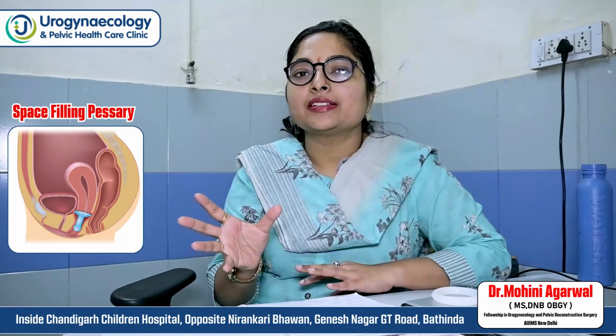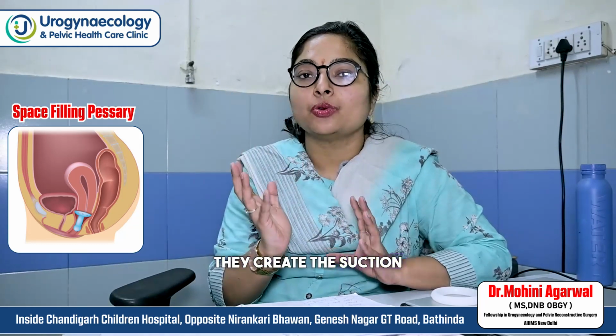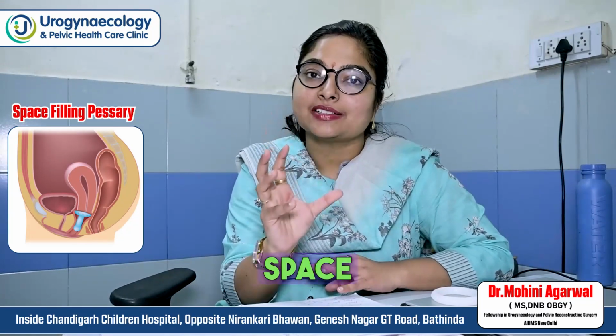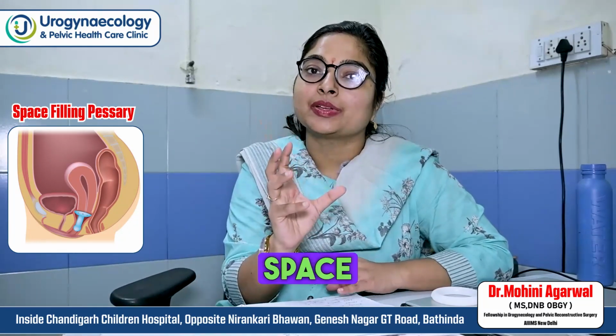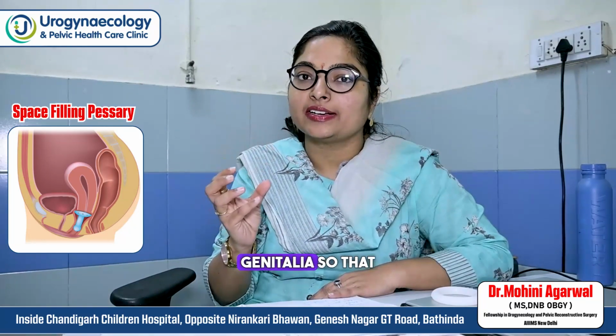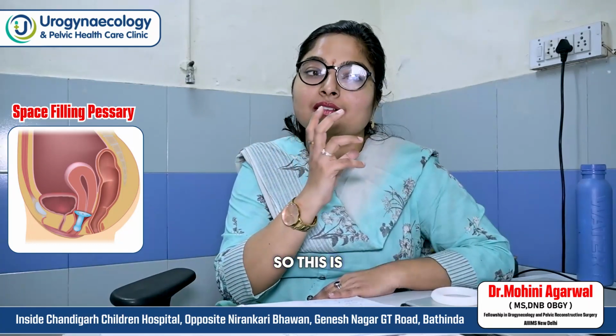Now the space filling pessary, their action is by suction. They create suction all over the vaginal wall. They create space in the vagina. Instead of the prolapse, they create a space, and they try to make the diameter more than that of the genital hiatus, so that the prolapsed part does not come outside. So this is the space filling.